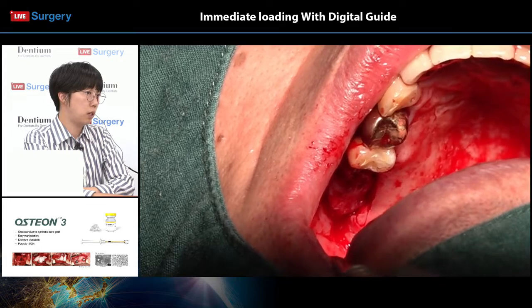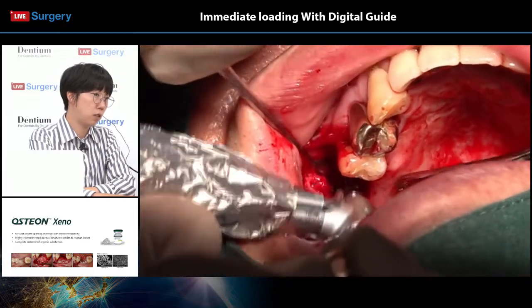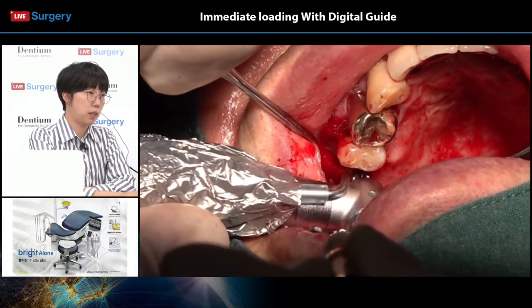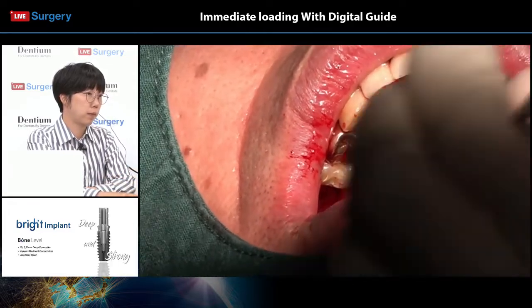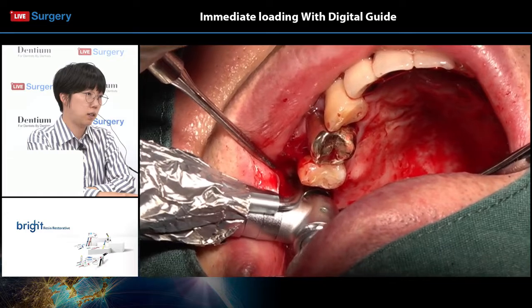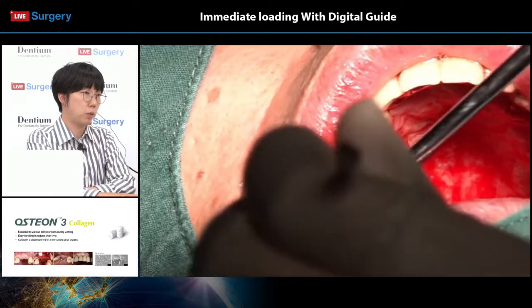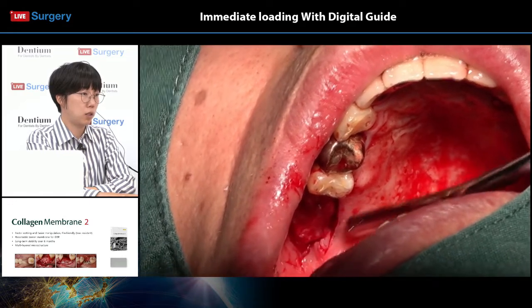Either the position or the initial stability of the implant was unsatisfactory for Dr. Lee. So he is, as I've mentioned before, performing additional drilling to the palatal side, so as to make sure that the implant is placed a little more palatally than the former position. So as in these cases, he is making adjustments in a freehand mode. As I've mentioned before, it's very important to have a good grasp on what you're doing in freehand mode surgery firsthand, and then get adjusted to using the digital guides.